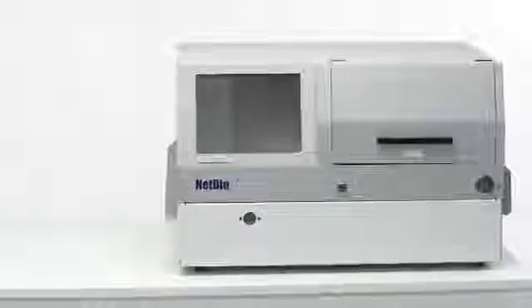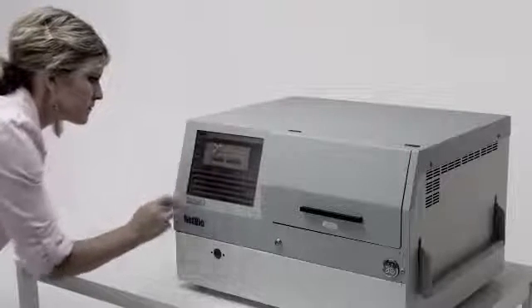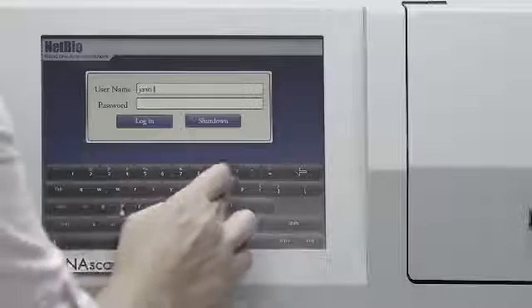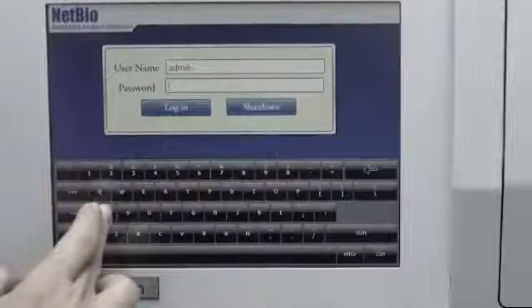When the warm-up is complete, the touchscreen monitor will prompt the user to enter a secure name and password. Three attempts can be made before the system locks that particular user out. Only the administrator can unlock a user, create new passwords, or create additional users.